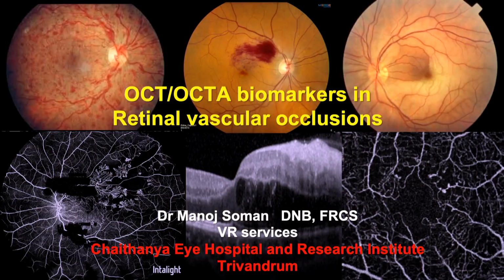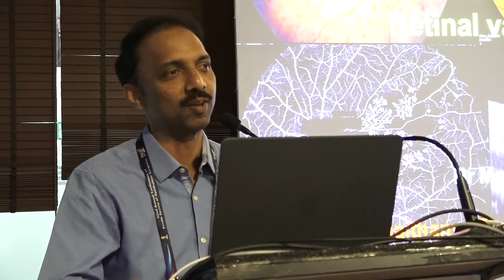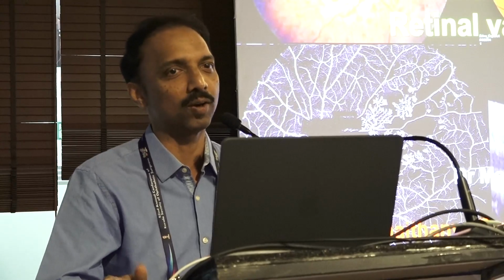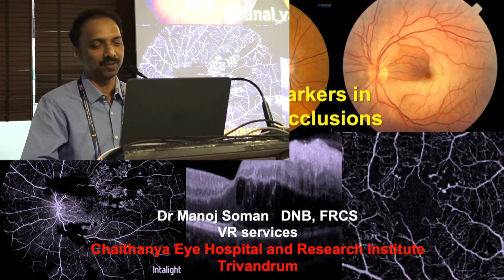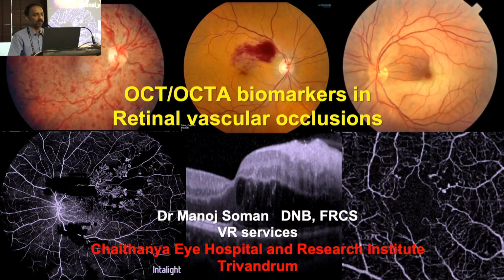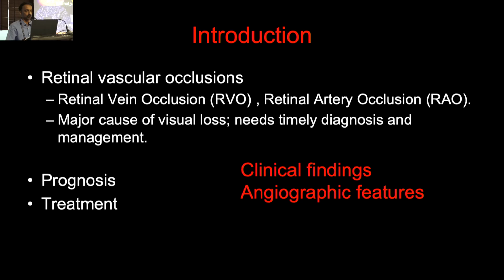Yeah, continuing with this trend of newer nomenclature. Now we, as retina specialists, are very fond of newer acronyms. So continuing with that trend, I'm going to introduce you to some more terms in this talk. Anyway, my talk is on OCT and OCTA biomarkers in retinal vascular occlusions.